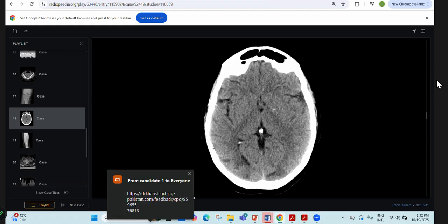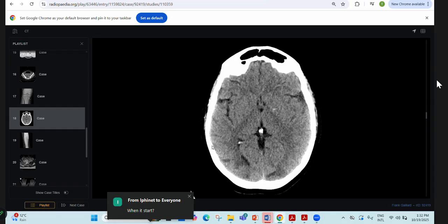Just like the tooth-like density in the X-ray. Why would the examiner help in that case? Because it is typical tooth-like, he will not. If you are not even mentioning that it could be a possibility in the differential, then he might help. But if you are straight away ignoring that typical shape, he will know that you don't know or you're not explaining it well.